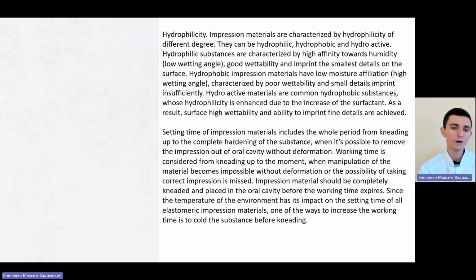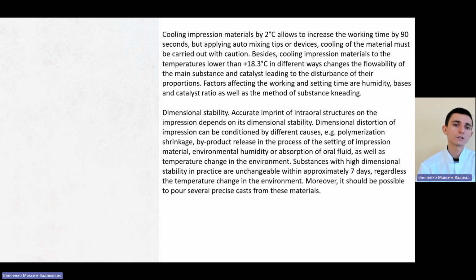Since the temperature of the environment has an impact on the setting time of elastomeric impression materials, one of the ways to increase the working time is to cool the substance before kneading. Cooling impression materials by 2 Celsius degrees allows to increase the working time by 90 seconds, but when applying auto-mixing tips or devices, cooling of the material must be carried out with caution.